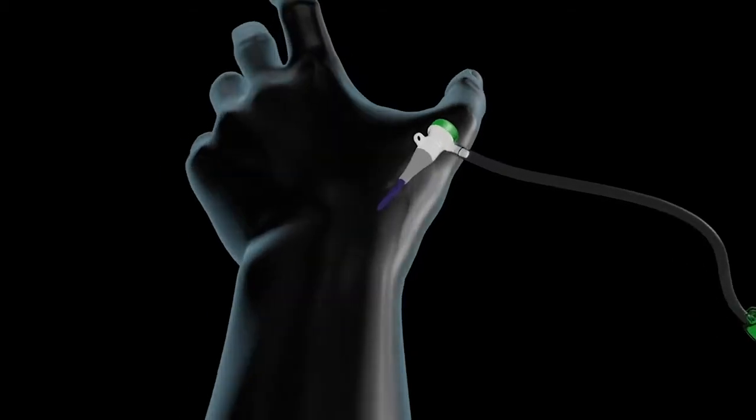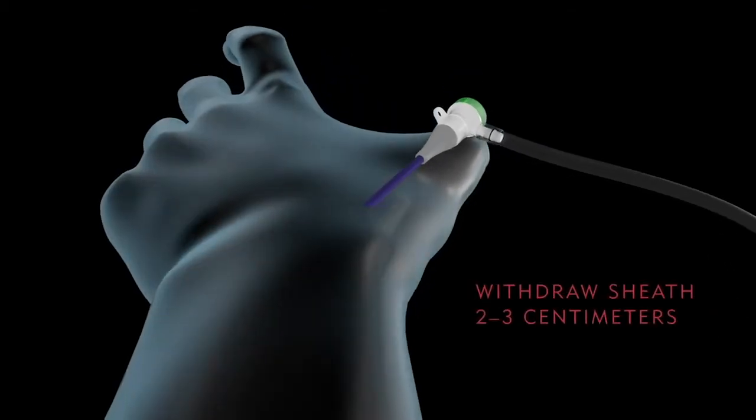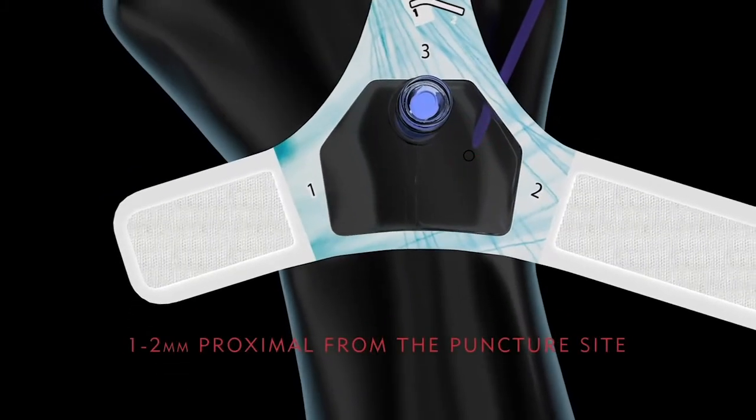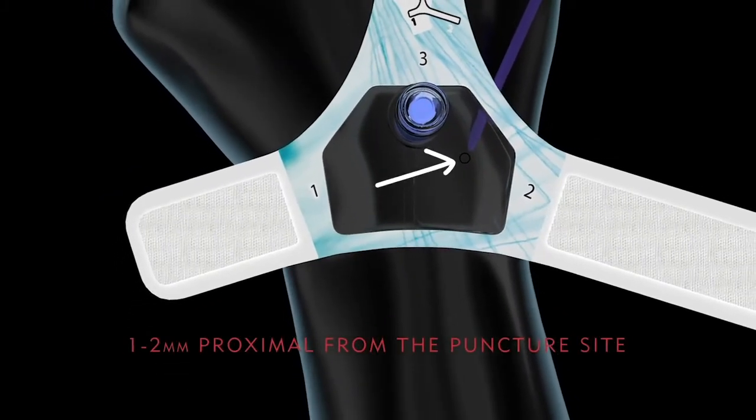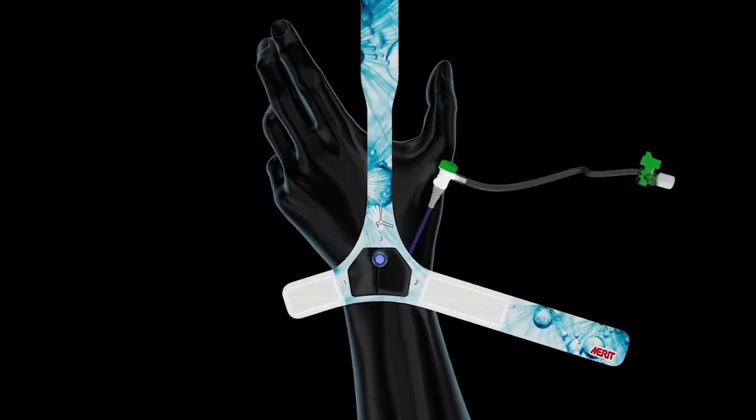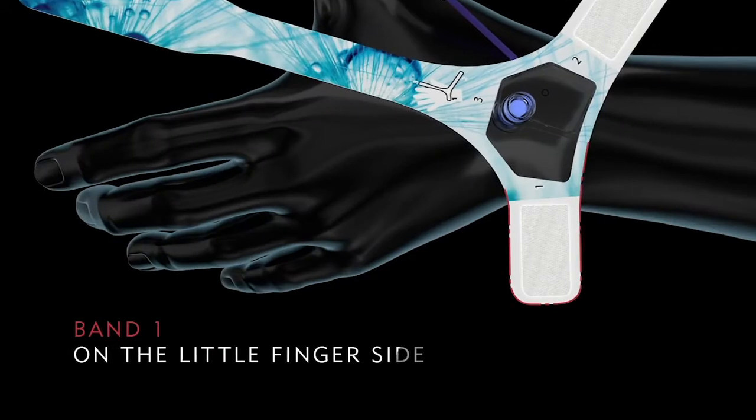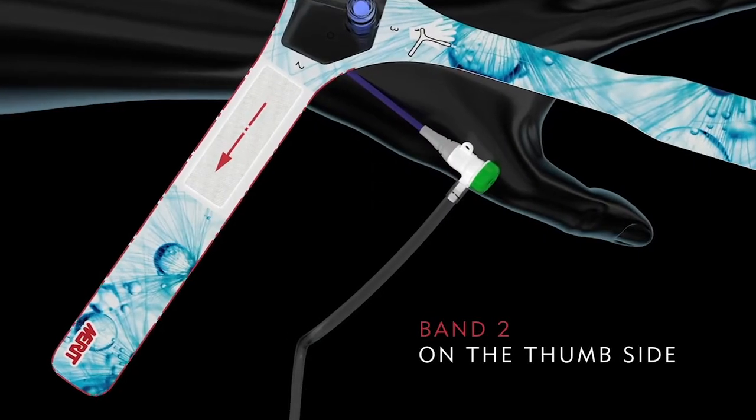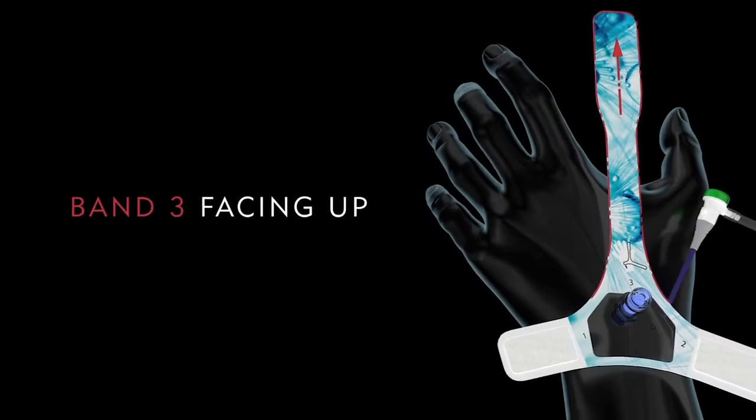Aspirate the sheath and withdraw the sheath back approximately 2-3 cm. Place the center of the crosshairs approximately 1-2 mm proximal to the skin puncture site. Place the band on the hand and wrist with band 1 on the little finger side, band 2 on the thumb side, and band 3 facing up toward the thumb.